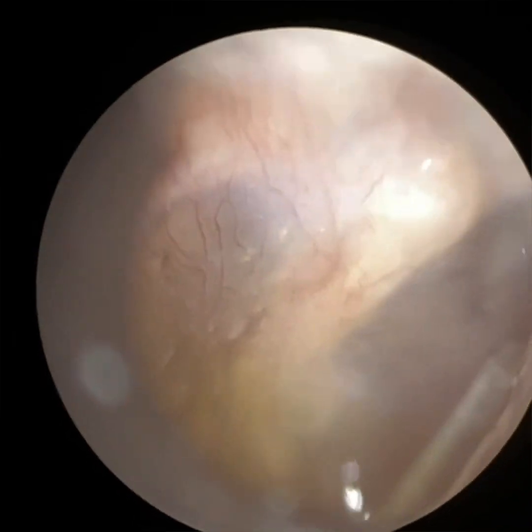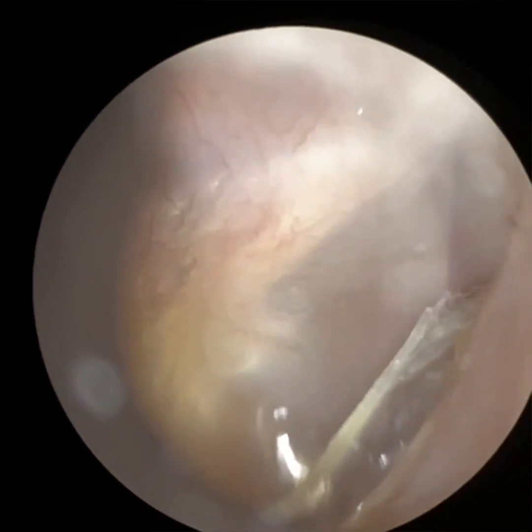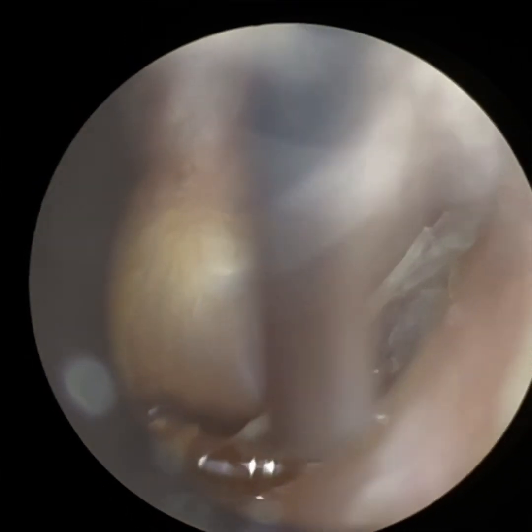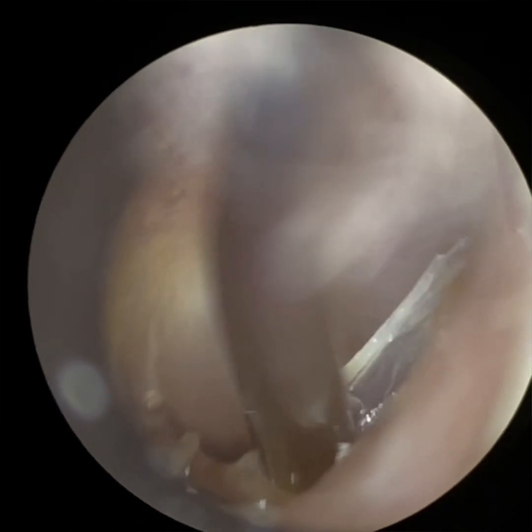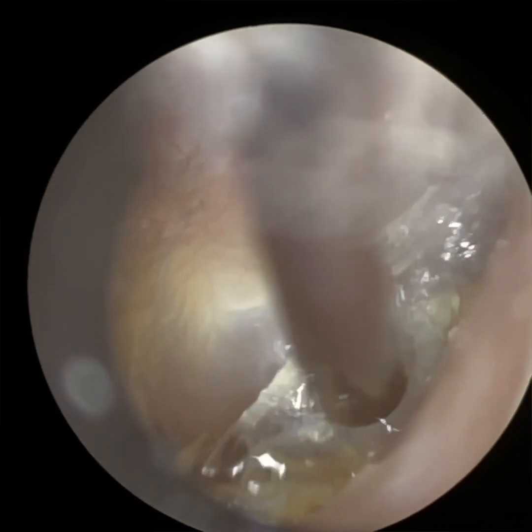It is quite a skillful technique to acquire and master, and so what I feel is lacking, if people are not able to use the endoscope, is what's the next best alternative in the market? And I think there's a big gap there. You've got ENT operating microscopes, which are of course fantastic, but they weigh a ton, they're not portable, and they're very expensive. You've got head microscopes.